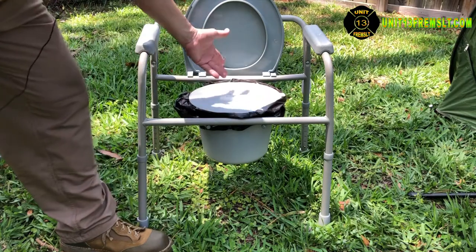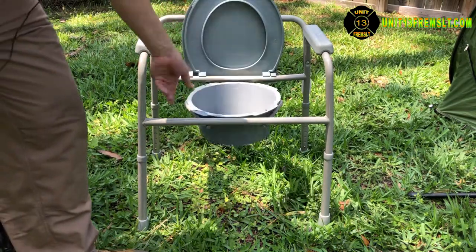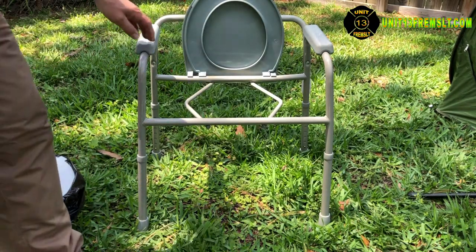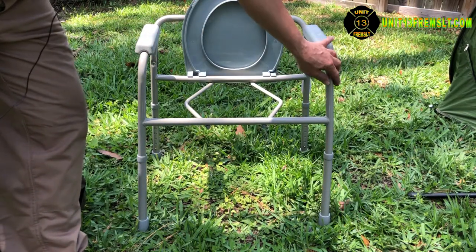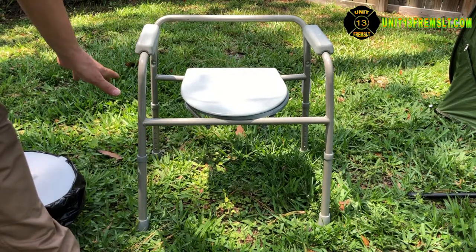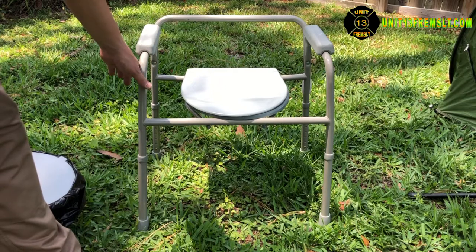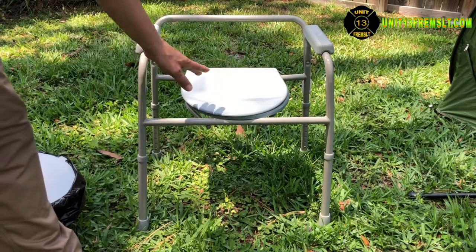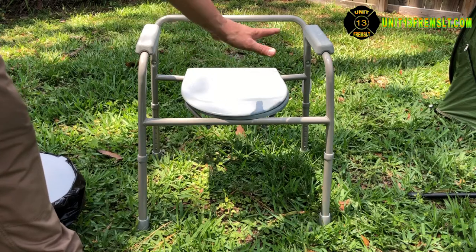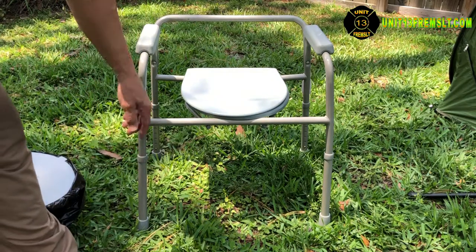This second model works the same way — you can use a bucket with it or a splash shield in the same ways I've shown. The big difference is that it doesn't have adjustable arms, so it would be very difficult for somebody to slide over onto it from a wheelchair. That's why I prefer the other model — you can move patients on and off more easily.